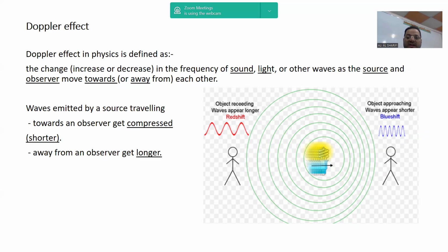from each other. That means that in the Doppler effect, I have three important contents. The first one is the observer. The second one is the source. The third thing is the distance between them. This distance is decreasing or increasing, and that will mean a huge difference.